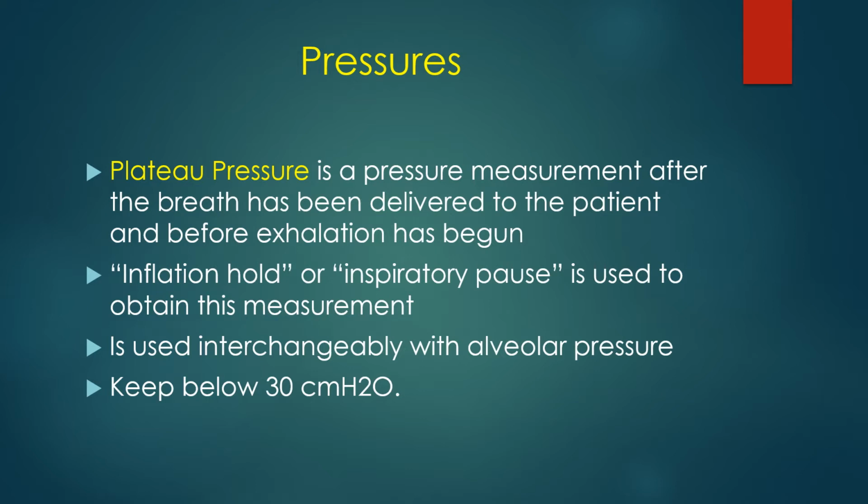And we want to keep that below 30 centimeters of water pressure. There have been many studies showing that patients have better outcomes if we keep that pressure below 30 centimeters of water pressure in all of our patients.